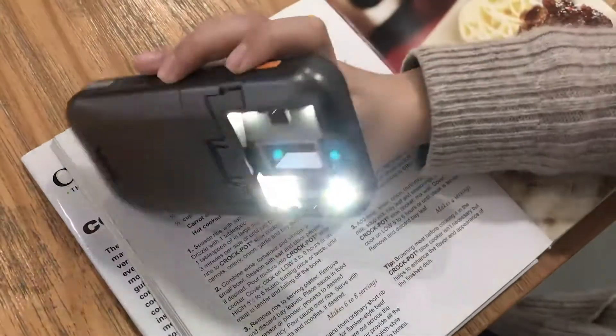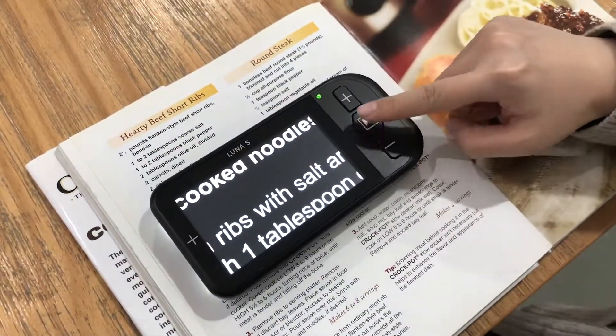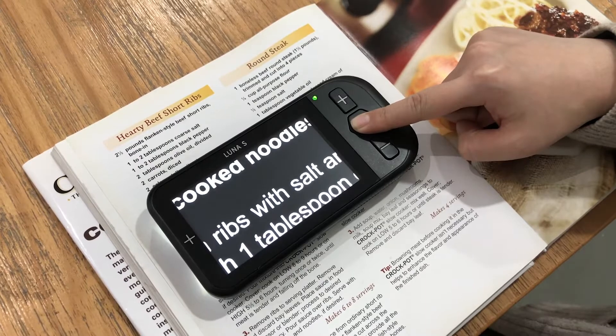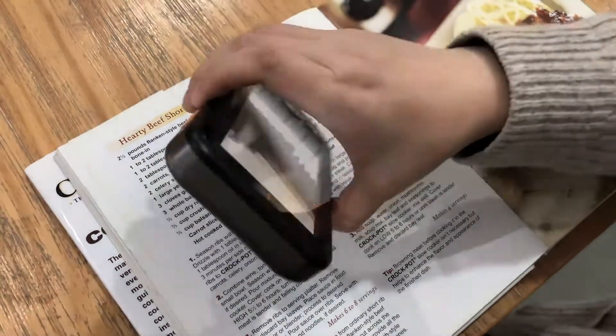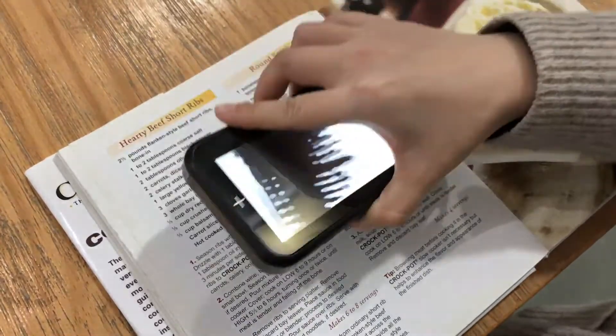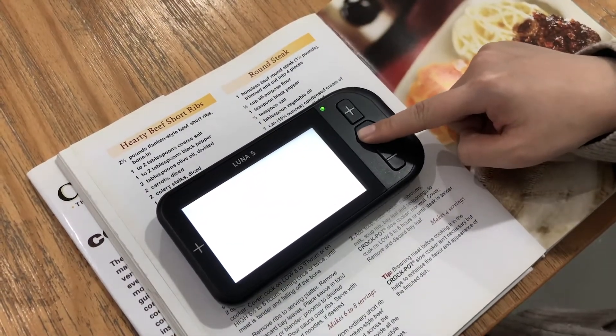By default, the camera light is on. To turn it off, press and hold the mode button for 5 seconds until you hear 3 beeps. The same action will turn the camera light back on.